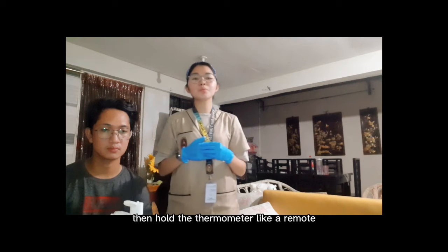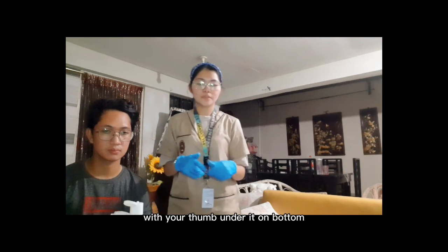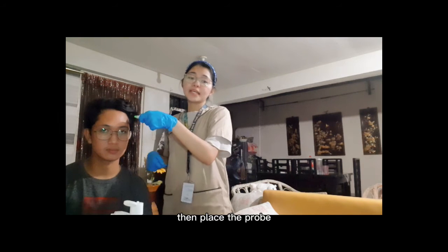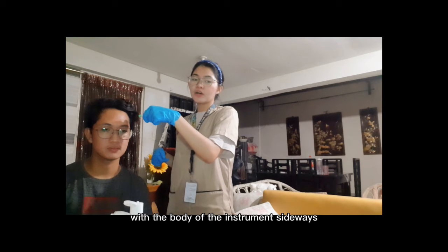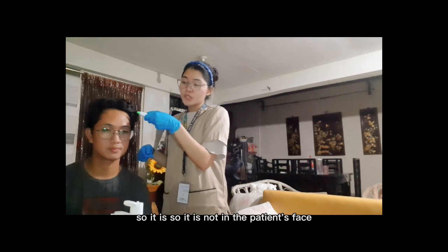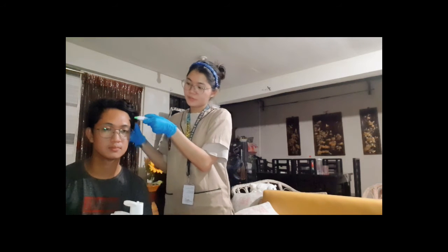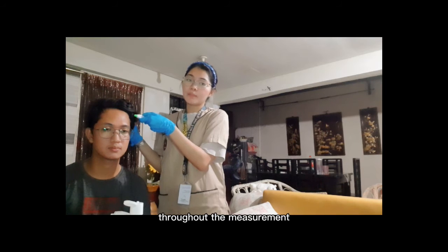Then hold the thermometer like a remote with your thumb on the red on button. Then place the probe flush on the center of the forehead with the body of the instrument sideways and not straight up and down, so it is not in the patient's face. Then depress the on button and keep the button depressed throughout the measurement.